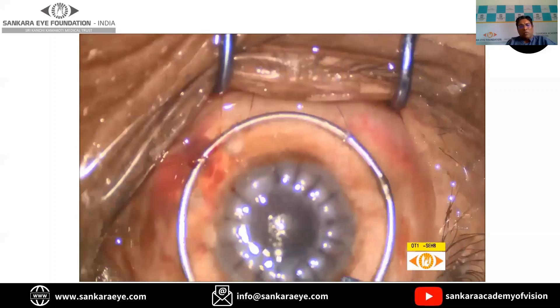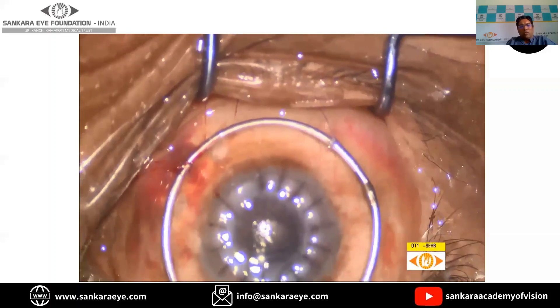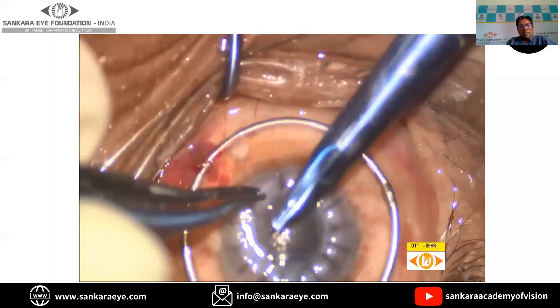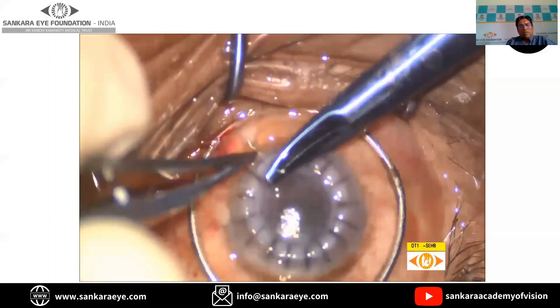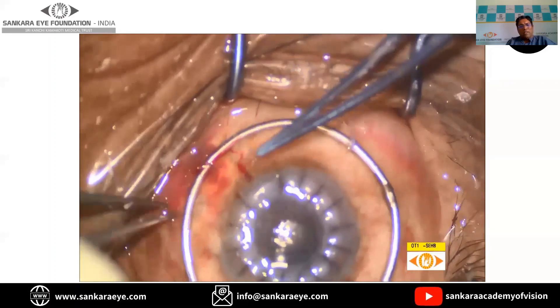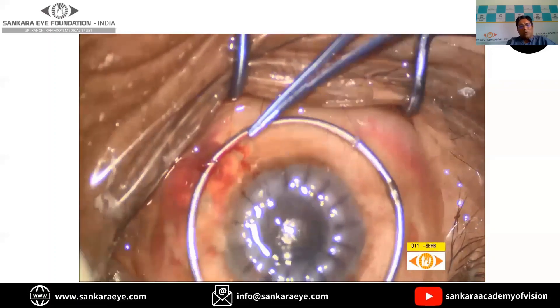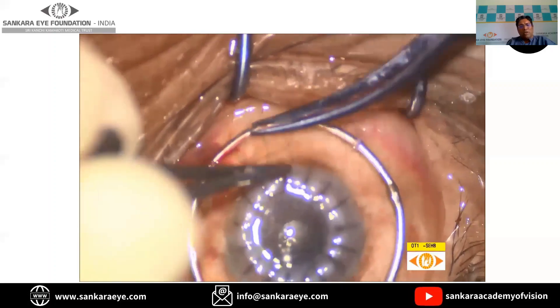Once all the sutures are placed, we have to look for wound leak, which is a very important step prior to closing the surgery. After doing this, it is always better to give a subconjunctival injection of an antibiotic-steroid combination.